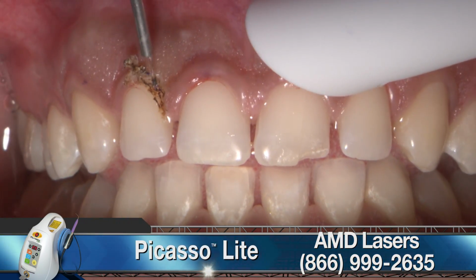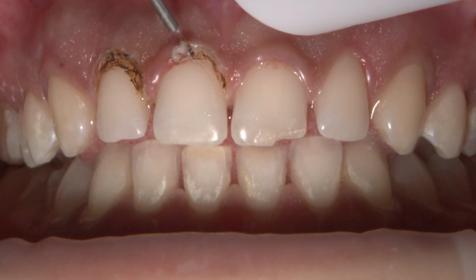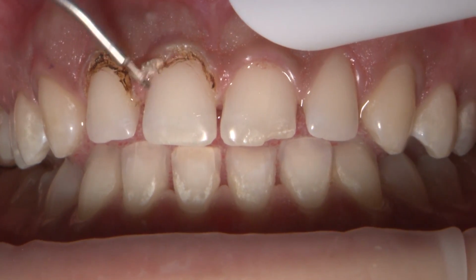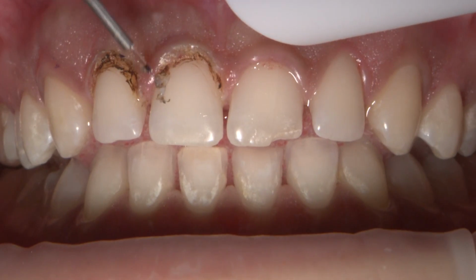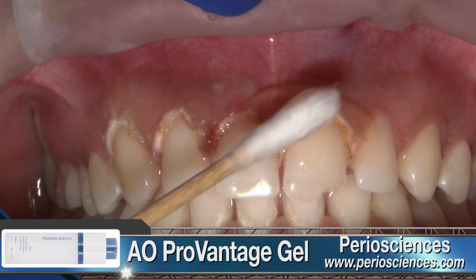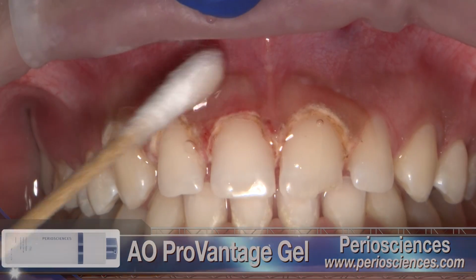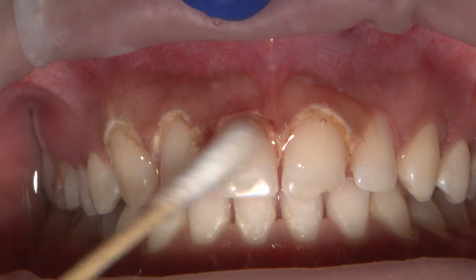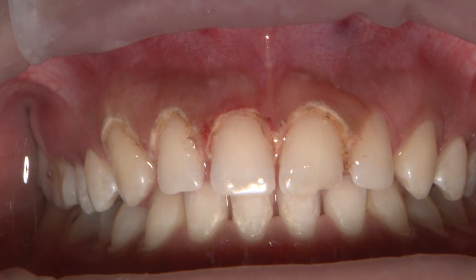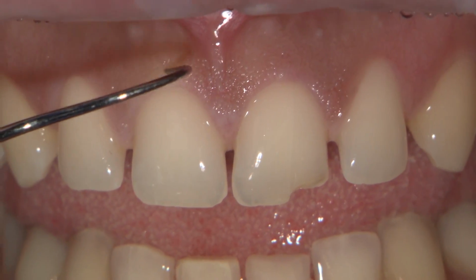I use brush-like strokes with the initiated tip and have my Picasso Lite laser set at 1.8 watts continuous wave. The tissue management with the Picasso Lite diode laser is easy and clean without bleeding. The healing is rapid. I use perio gel to aid with tissue healing, and most patients report very little to no post-op discomfort. I send the patient home with this PerioScience gel and instruct to apply 5 times a day for 5 to 7 days. After a period of 4 weeks, the patient came in for evaluation.